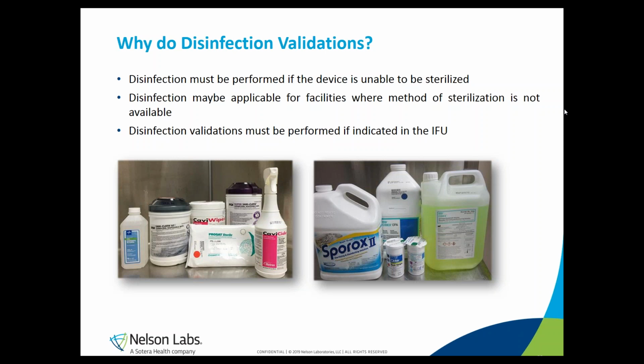As you already heard from Stefanie, for cleaning, you will need to choose an appropriate detergent. Well, for disinfection, you will need to select an appropriate disinfectant. And also here, it is important to choose products that are available to healthcare facilities and that do not compromise the integrity of the device when they are used in the intended concentration and contact time. Anyway, if a disinfection procedure is indicated in the instruction for use, it must be a validated method.